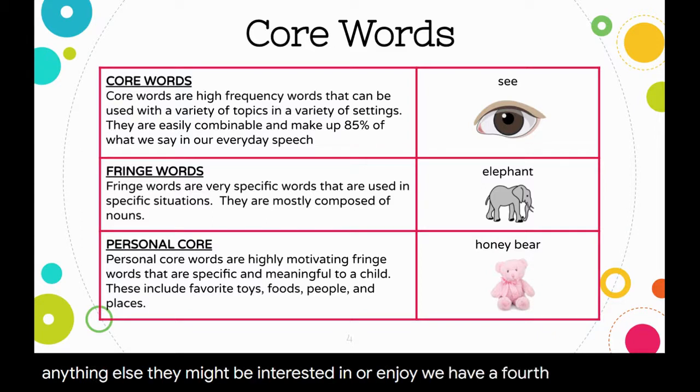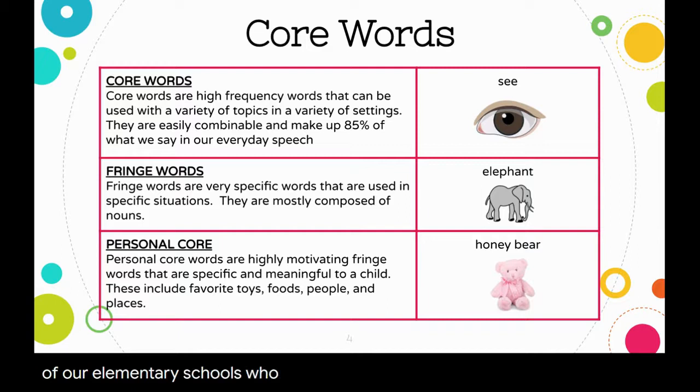We have a fourth grader at one of our elementary schools who uses an AAC device, and he is a history buff, so he has added vocabulary to his device to be able to talk about the Civil War and Vikings and other topics that are personal core to him.